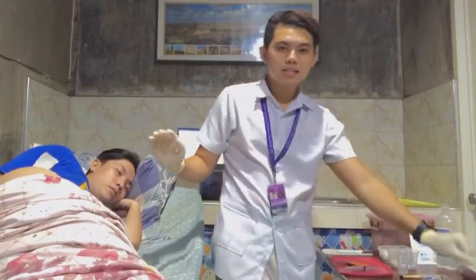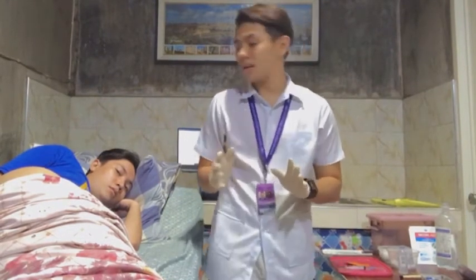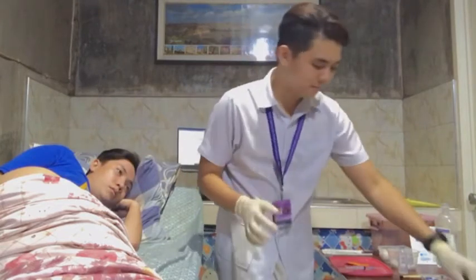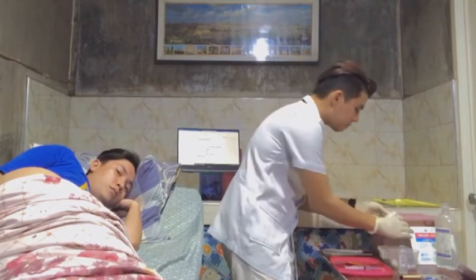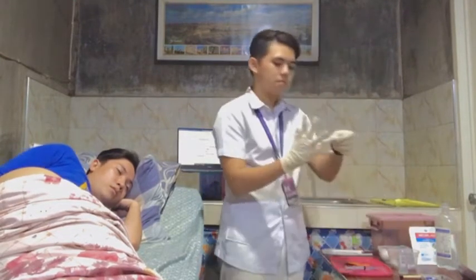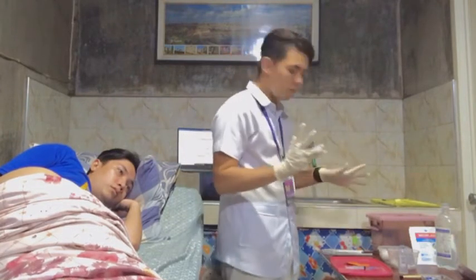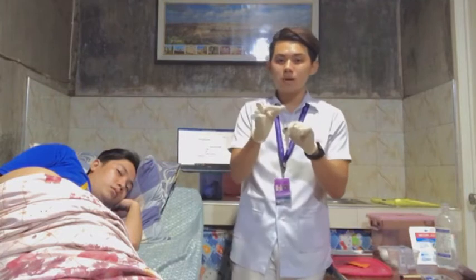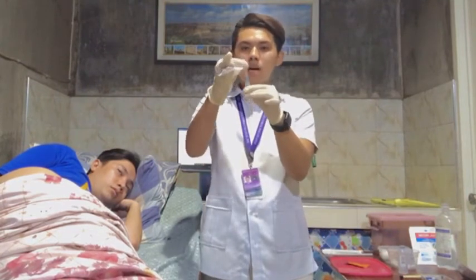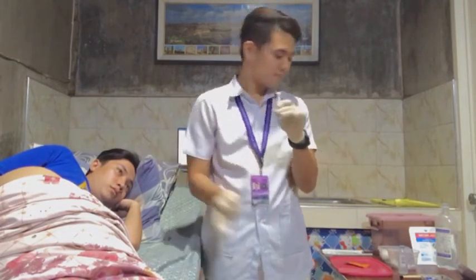Next, we need to hold the gauze pad between the 3rd and 4th fingers of your non-dominant hand. This will be the gauze pad. Just like this, we need to hold this like this. After that, we will be removing the needle cap by pulling it straight up and hold the syringe with the thumb and forefinger of your dominant hand, like you are holding a dart.